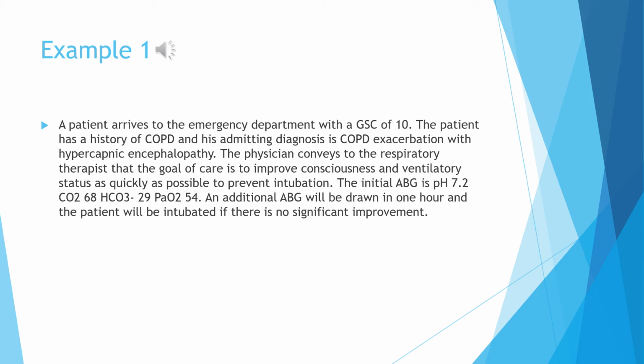Since studies have shown that AVAPS turns patients around faster and wakes them up more quickly than ST, AVAPS would be an effective mode in preventing intubation in this patient.